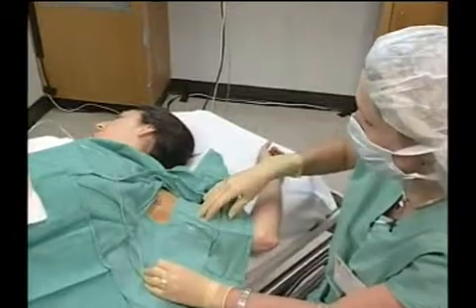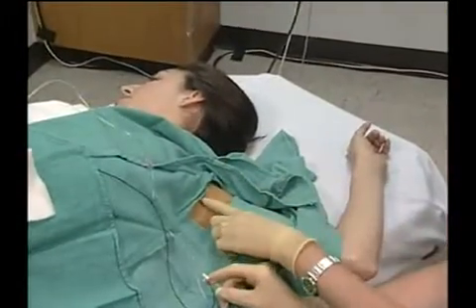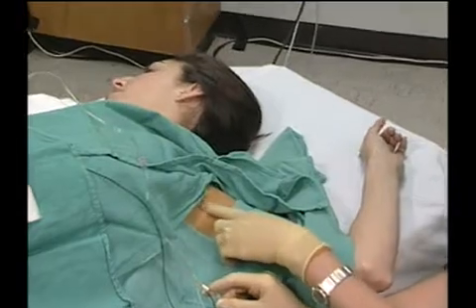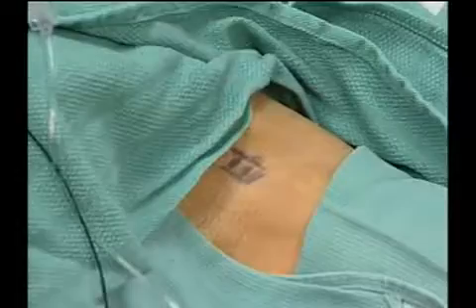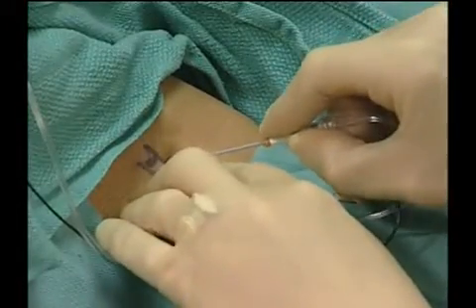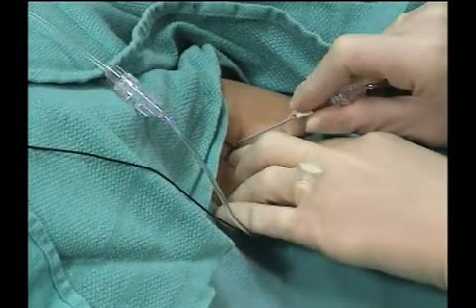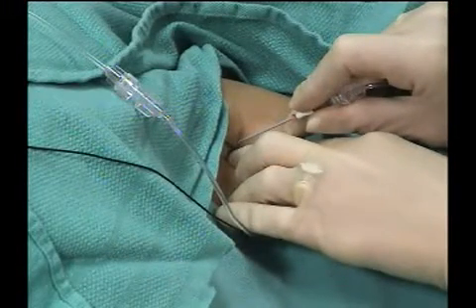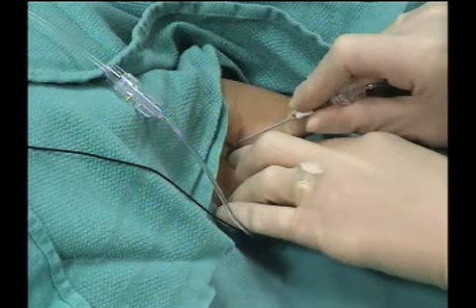The patient is placed in supine position with the arm abducted and the forearm flexed. The axillary artery is marked. Next, a 50mm ProLong needle connected to a nerve stimulator is introduced above the axillary artery at a 45-degree angle along the deltoid and biceps groove in search of the stimulation of the median nerve.